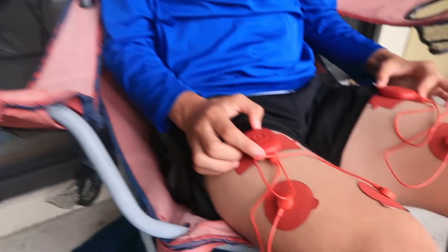So what we're going to be doing today, like I said, is putting it to work while I'm standing. You guys saw the last video — I did it with nothing — and this video is going to be with electrical stimulation. First, I'm going to put it on Roman so you guys get an idea of how it works and how powerful it is, and then we'll get to that.